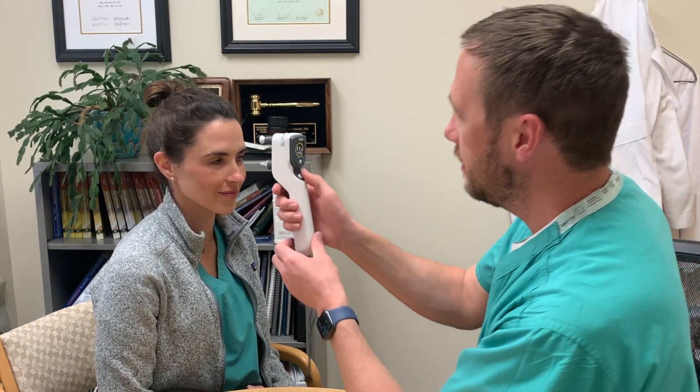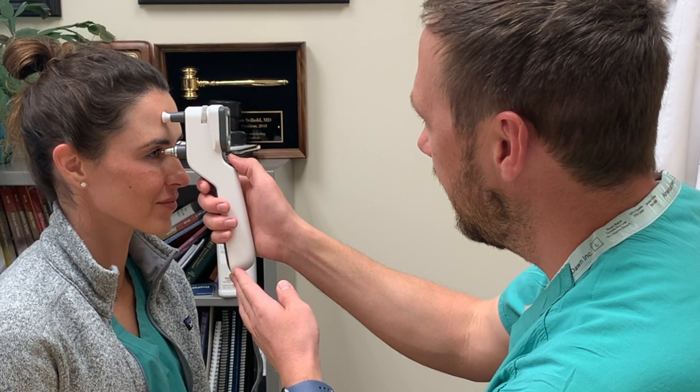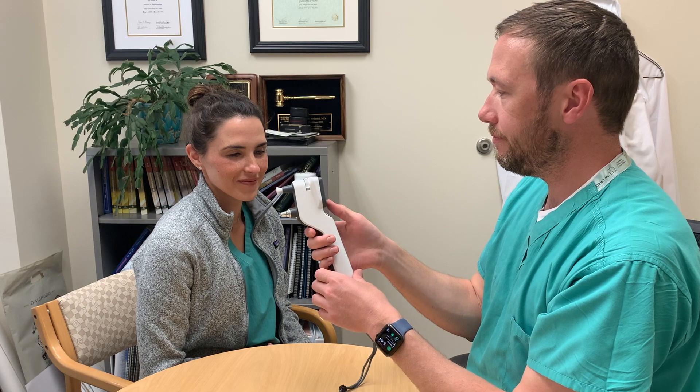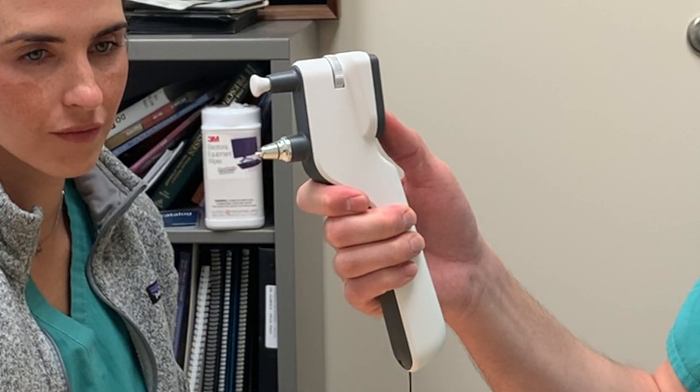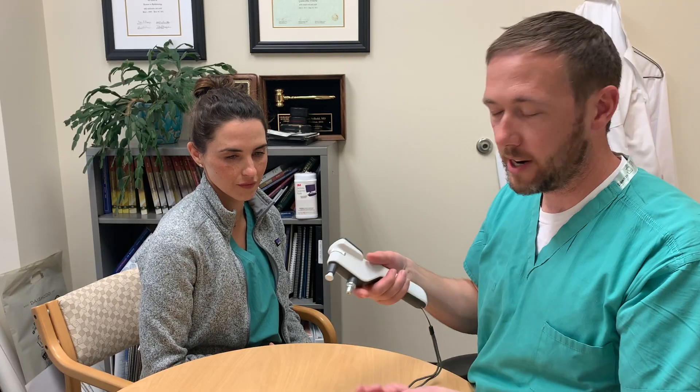If the circle lines around the reading are green, that's a highly reliable reading. If they're yellow, it's borderline — you should probably repeat that. We'll repeat the reading, and now I have a reading of 12.7 with a green circle indicating a more reliable reading. When you're done with the measurement, hold down the stop button until the probe is released, and then you can dispose of it in the trash can.